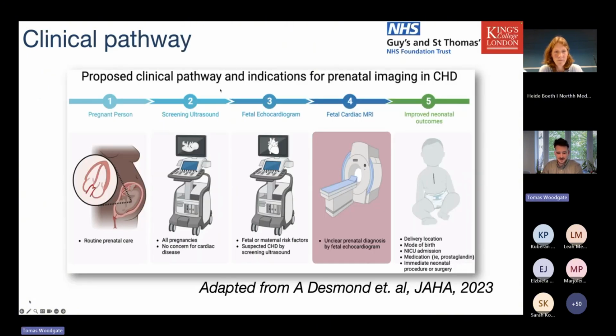Our clinical pathway, I've taken this picture from this nice review paper by Desmond et al. in 2023, and it shows more or less a similar thing to what was displayed before, where patients will at some point make their way to fetal cardiology, be that on the basis of an abnormality being detected on screening or risk factors. And in certain cases, fetal cardiac MRI will be requested. A slight difference is that it's very rare that we have cases where there's a particularly unclear prenatal diagnosis. In our own practice, it's more that they're selected cases where additional imaging from fetal cardiac MRI may be valuable. And we'll talk about what those are.